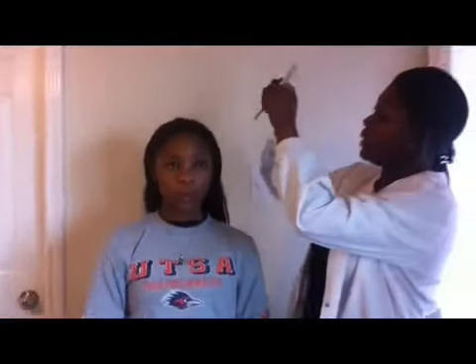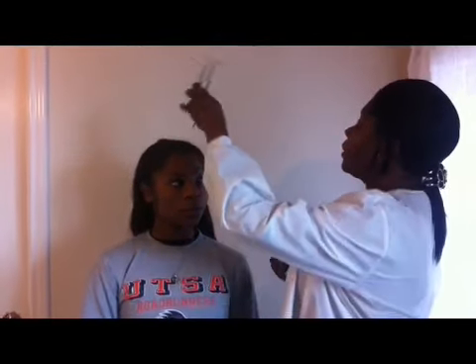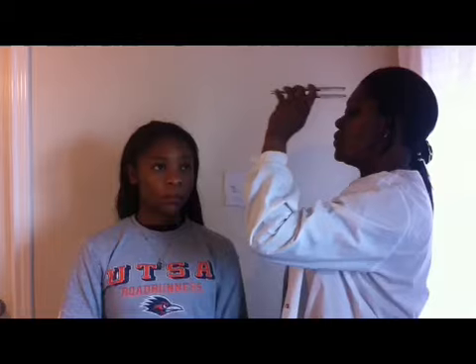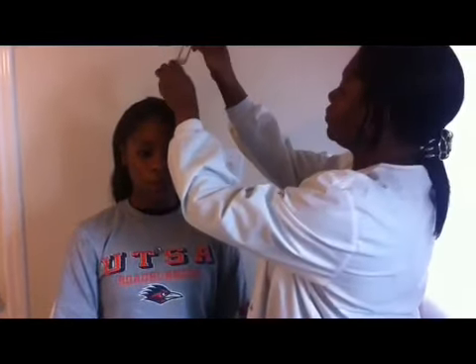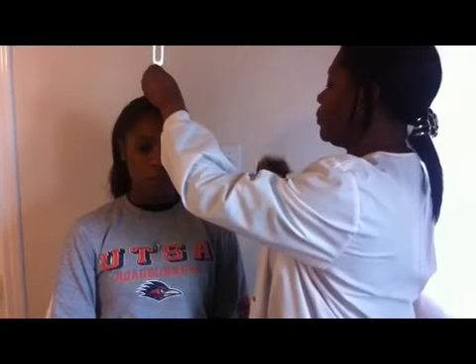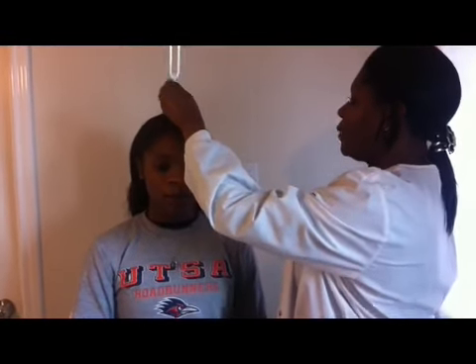And the next test we'll do is the Weber test. I'm going to strike this tuning fork and you tell me if you hear the sound bilaterally in both ears. Yes. Did you hear it more in one ear or less? I heard it equally in both ears. Equally, great. Okay. And I'm also going to do the Rinne test.